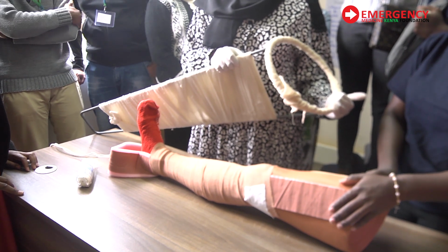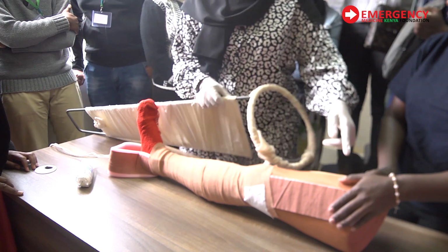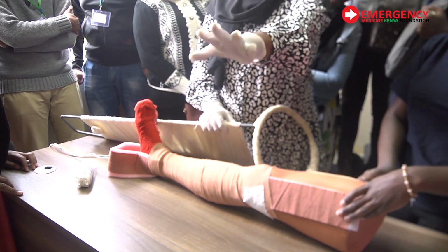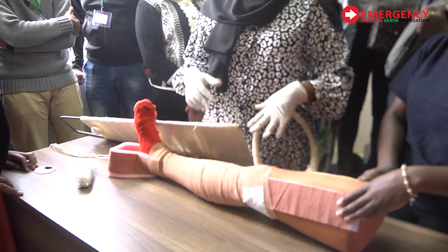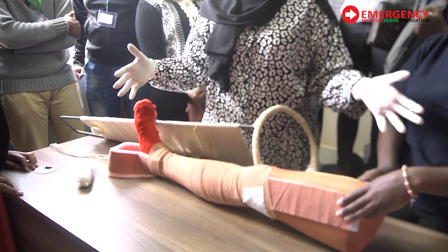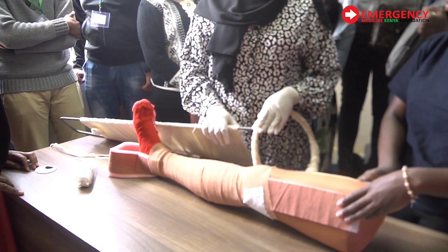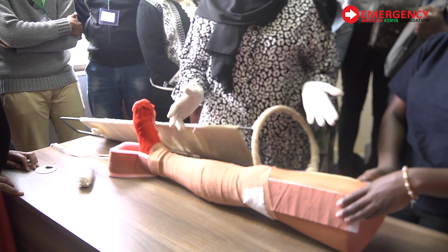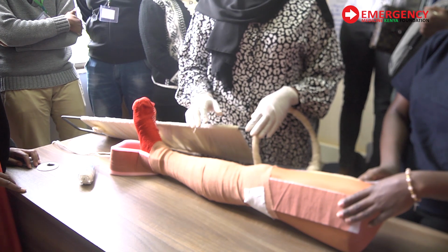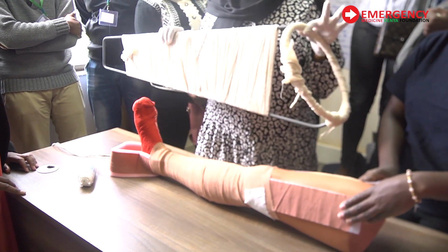So what do you do? There's a way you measure for this. The way you measure is between the gluteal fold of the patient on the normal leg. You measure, and then you add 10 or 15 centimeters, because you expect this leg to be swollen, right? Then you come and measure this circumference. That gives you the right size for the patient, okay? But I know in low resource setting, you may basically have one, right?